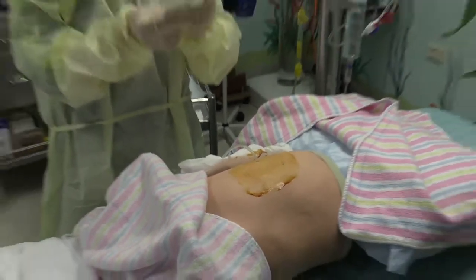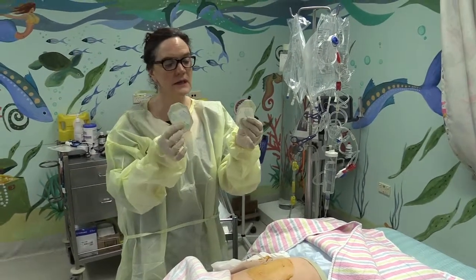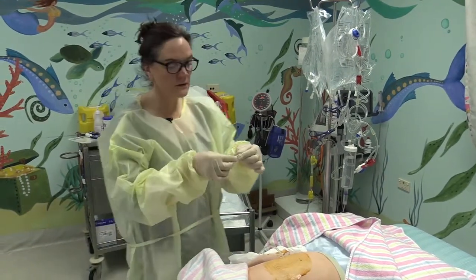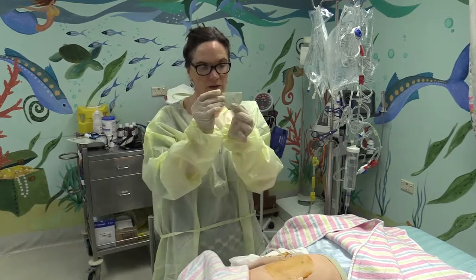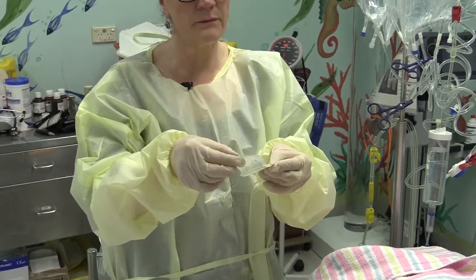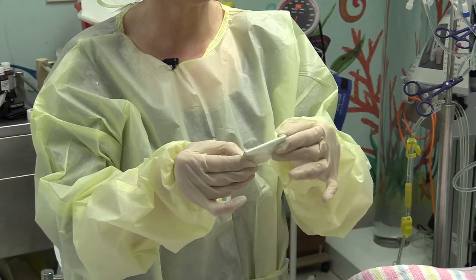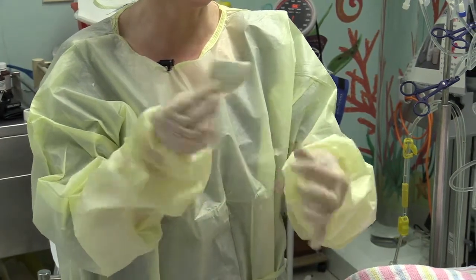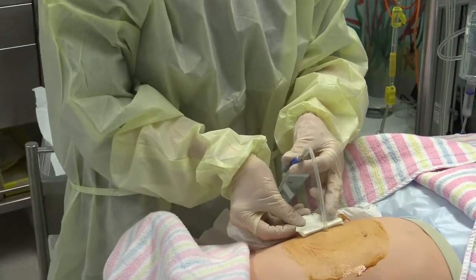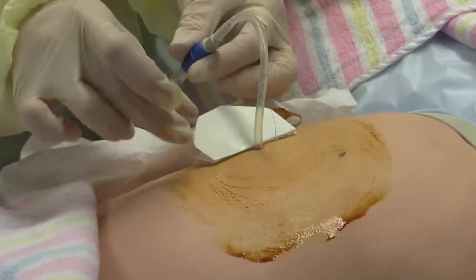I'm going to envelope the catheter between 2 sterile Tegaderm dressings. So to do that, I fold one in half, like so, and then I'm going to peel back the backing so that the sticky surface will be placed onto the skin underneath the catheter, like so. Make sure that it's stuck.